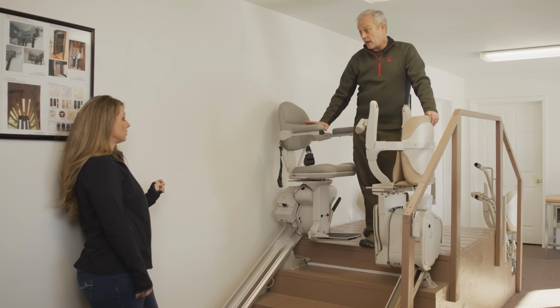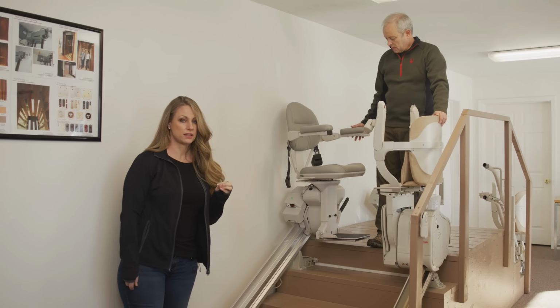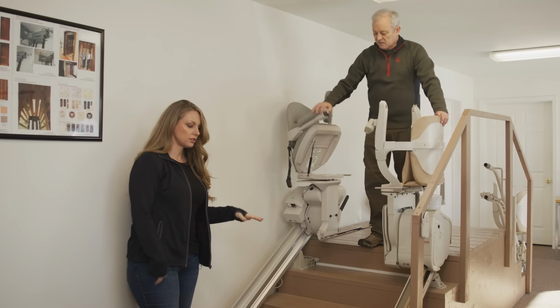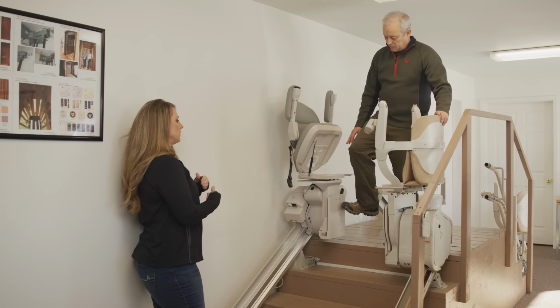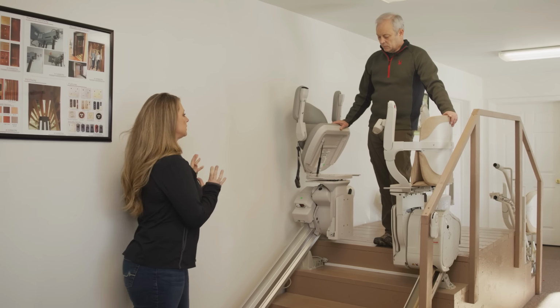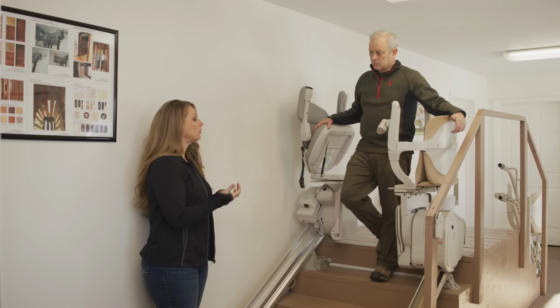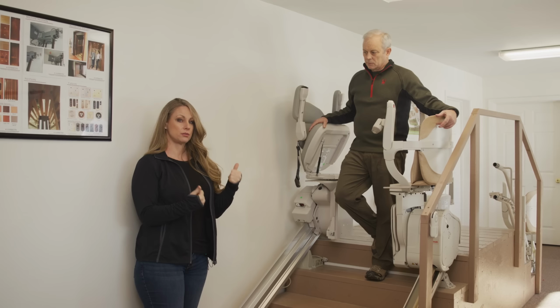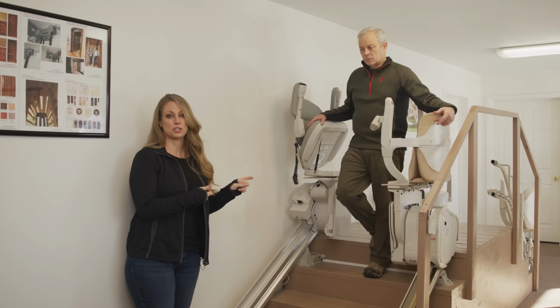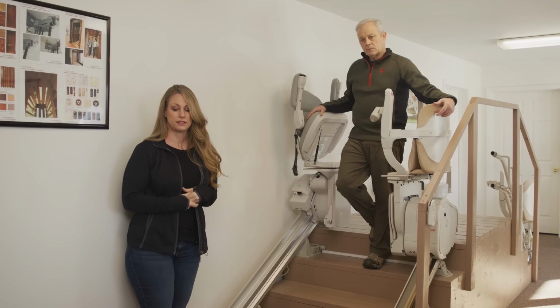So you do have emergency exiting even in the event of a power failure. For me, in my experience with ALS, one of the things I would say is that long-term, this is not a solution for ALS, because with ALS, families should plan for full paralysis. But that doesn't mean it's not an option. If mobility challenges are happening and you don't have a solution for how to get to the bedroom and bathroom upstairs, and your loved one is still able to move, this is actually an option. It's just not a long-term option if their progression is fairly fast.